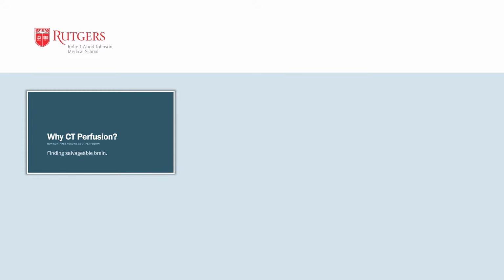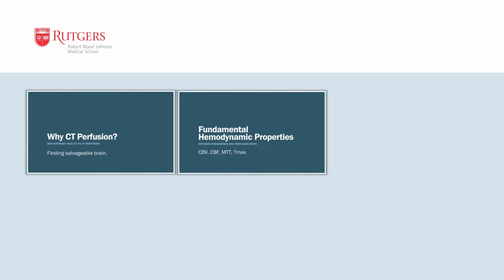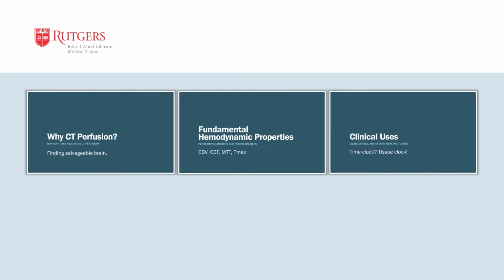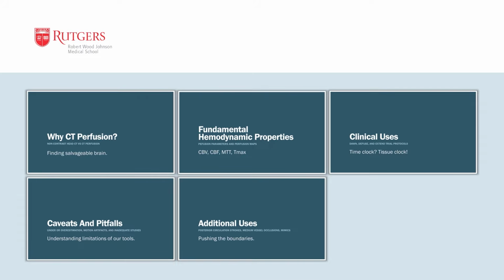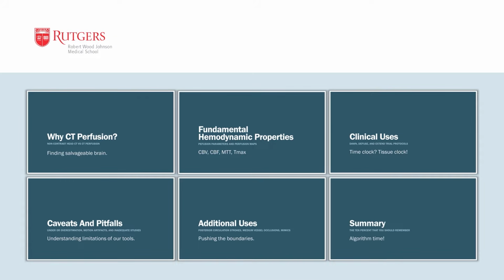Why do we need CT perfusion? Well, hopefully that will become clear in the first section. We will then discuss the fundamental hemodynamic properties, review well-validated clinical uses of CT perfusion, discuss some caveats and limitations, and conclude with some additional uses of this imaging tool and a tidy algorithm to bring it all together.